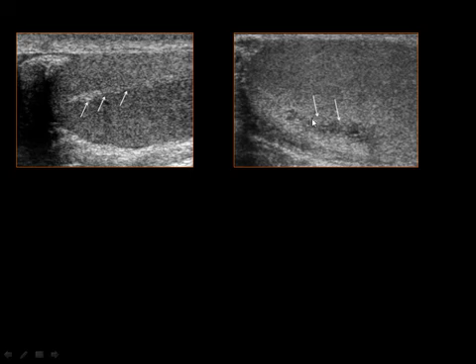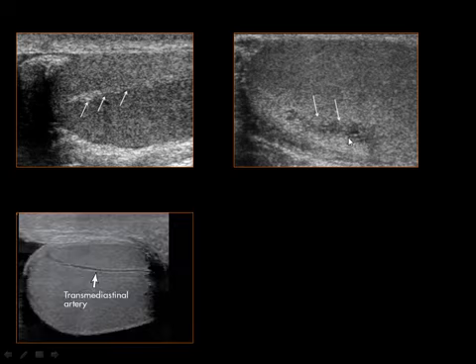This is the mediastinum. It appears as a highly echogenic linear structure that extends craniocaudally within the testis and parallel to the epididymis. It is draining the seminiferous tubules of the testis into the rete testis. This is the rete testis, which appears as a low reflective area at the hilum of the testis with finger-like projections into the parenchyma.